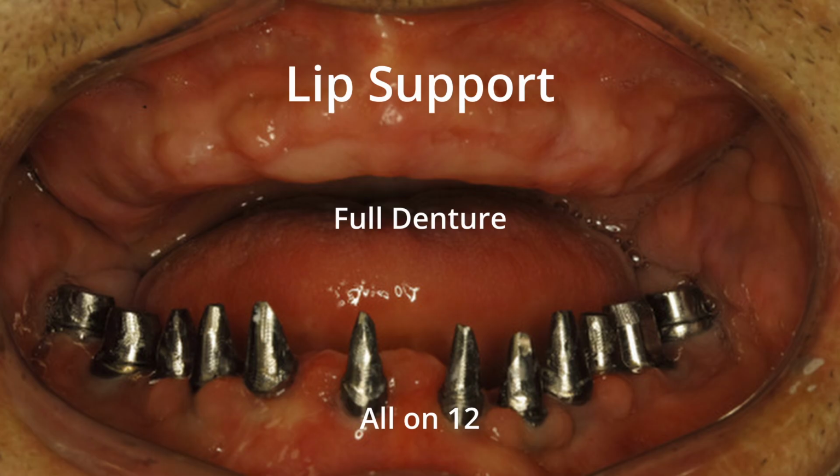Especially in maxillary AllonX cases, increased load is transmitted to the implant fixtures, creating additional stress. In other words, increased prosthesis weight due to gravity is transferred through the abutments to the implant fixtures and dissipated through the surrounding bone. However, when a removable denture is used in the maxilla, occlusal load distribution is not a major issue. Few clinicians discuss lip support problems in mandibular removable dentures or mandibular AllonX cases.